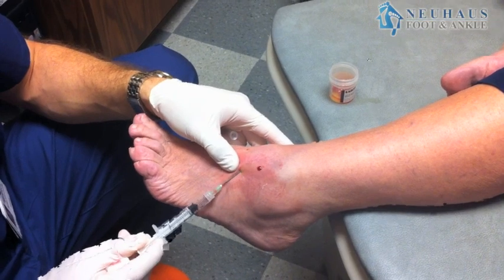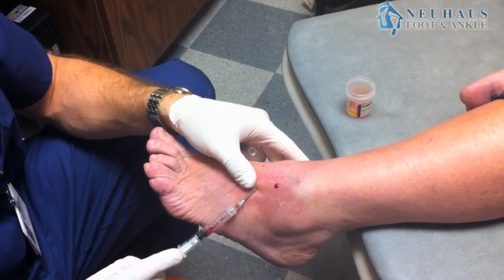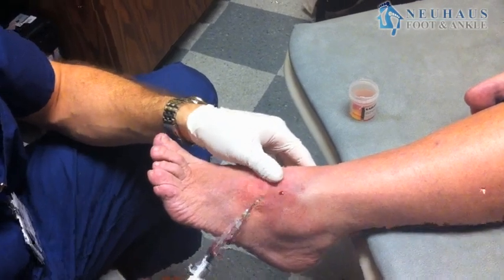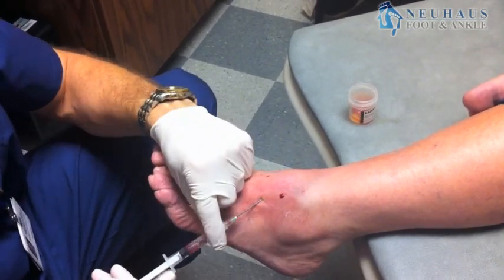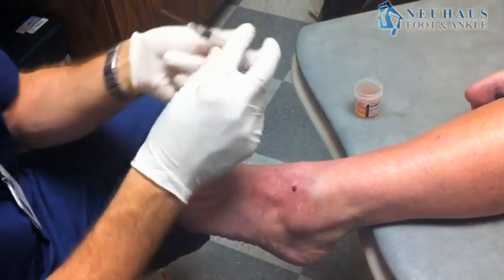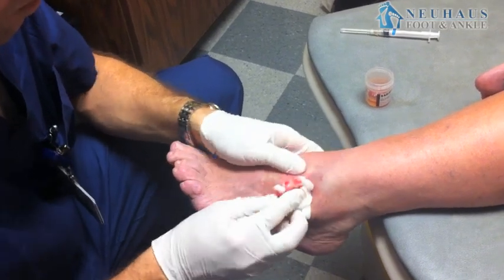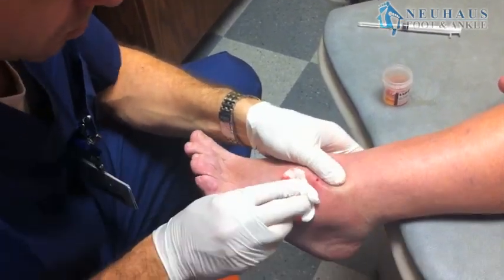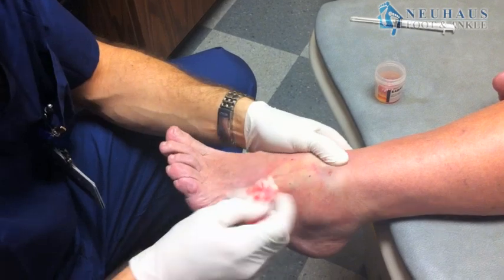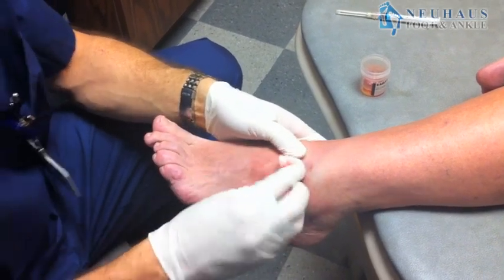The body will stop producing fluid in the water-balloon type effect where it gets swollen. I find that a cortisone injection and draining like this works probably half the time. Sometimes I will do multiple injections, though it's not uncommon to need to surgically go in and remove a very large cyst like this. Even after surgery sometimes they can be very persistent — even when you cut away all of that tissue they can come back. Here you can see a very good example of a large ganglion cyst on the top of the foot. We drained a lot of fluid out of it, and I've gone in through a different area and tried to spread out where I'm putting the cortisone to get this thing to shrink up and go away.